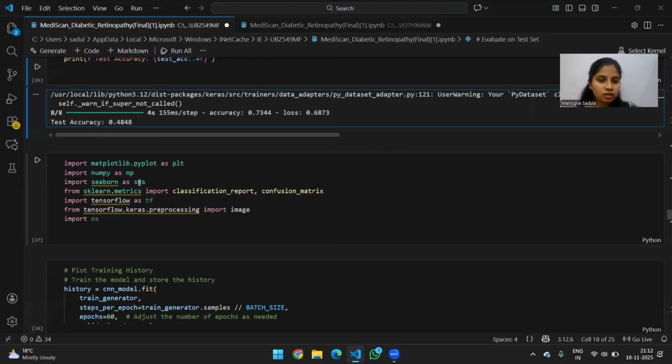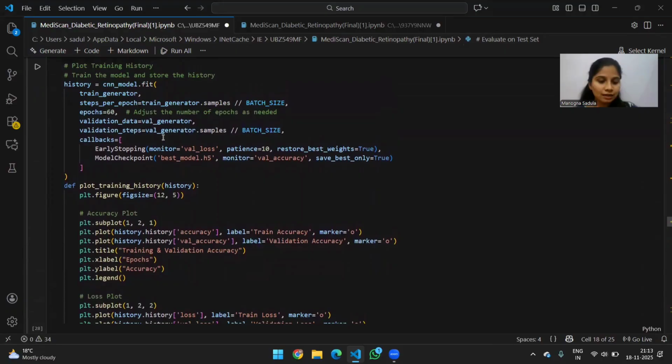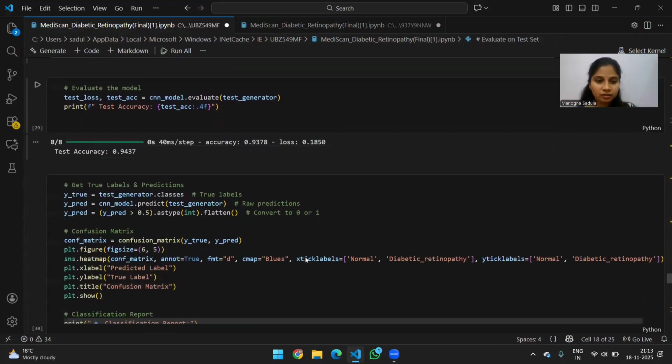And here we imported a few necessary libraries to plot the graphs and also to generate the confusion matrix. And coming to this block of code, we plotted the training as well as validation accuracy and the loss graph using the history recorded during the model training. Coming down here, we have two graphs. The first graph is the accuracy graph, where the model's accuracy has improved, but the validation accuracy has fluctuated a bit, stating that the model struggled to generalize well. And the second graph is a loss graph, where the training loss has decreased but the validation loss has stayed high, stating that the model is overfitting.